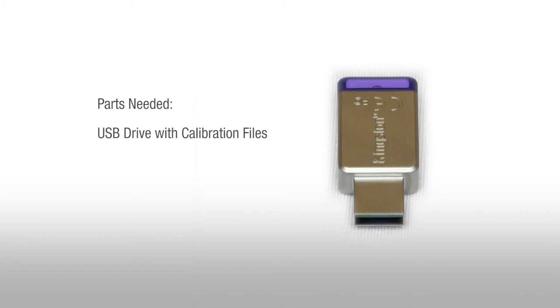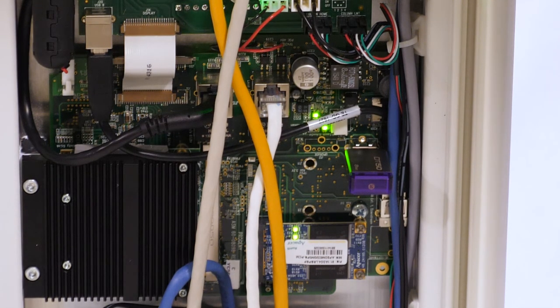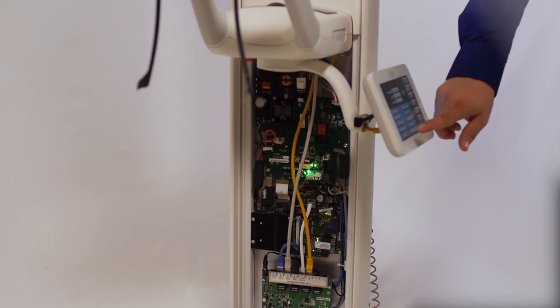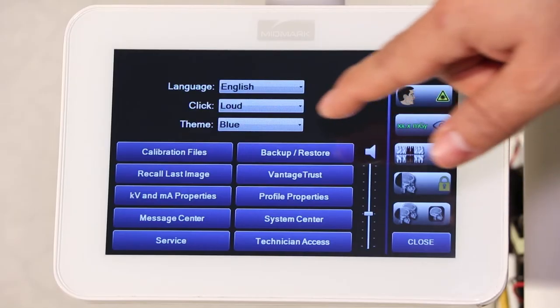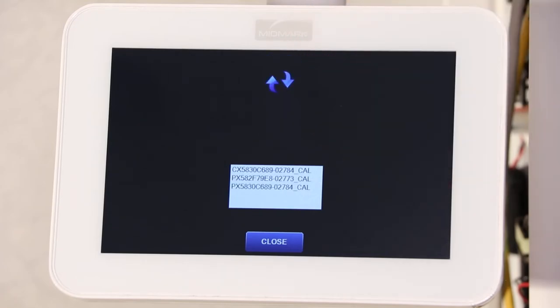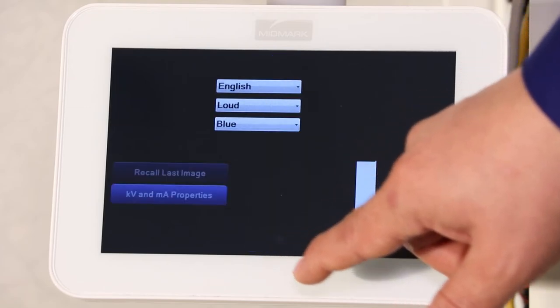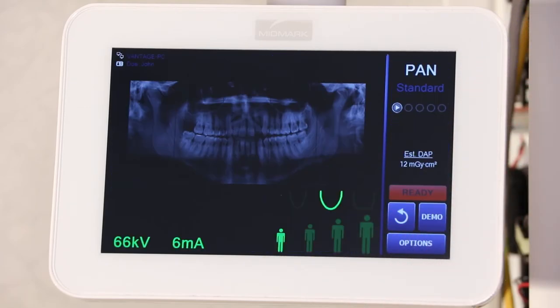Install calibration file. Locate the USB drive containing the calibration file and plug it into an available USB port on the carrier board. Select Options on the lower right corner of the operator panel. Select Calibration Files on the upper left. This window will display the calibration files loaded on the USB drive. To load the calibration files onto the system, press on the green arrow. The calibration files will begin transferring. When the transfer is complete, a green check mark will display. Select Close and remove the USB drive. Now turn the Vantage off, wait 60 seconds, and then turn it back on.